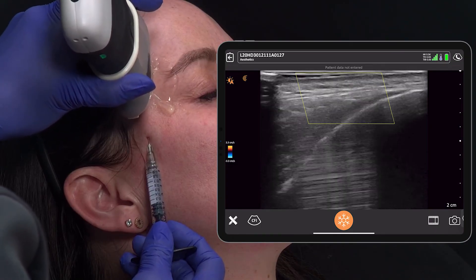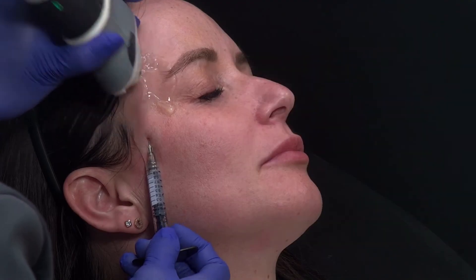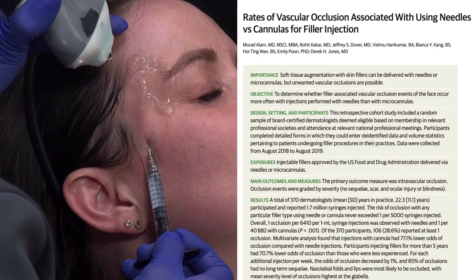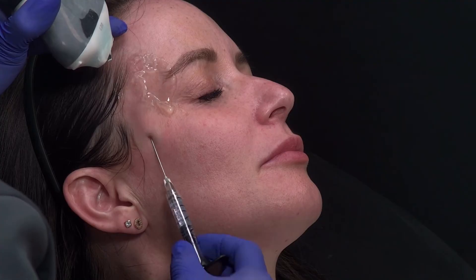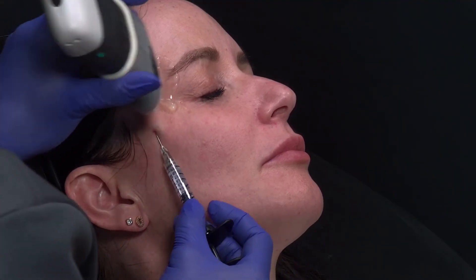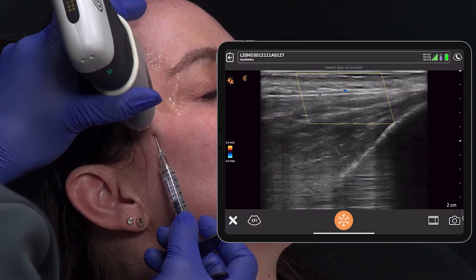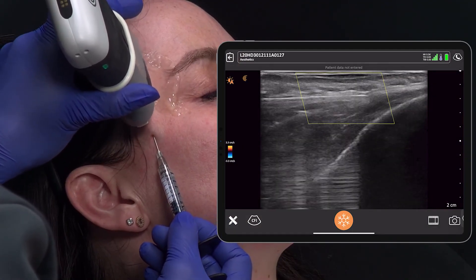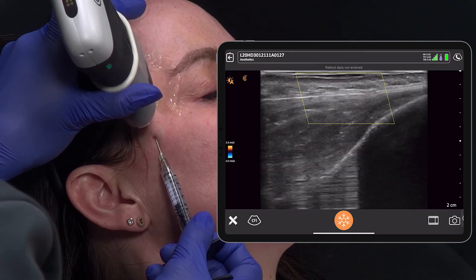You can see I'm using a 22-gauge cannula here, which is my standard gauge for most things. Although the 2021 ALAM paper alludes to cannulas being 77% safer than needles, I have seen some nasty occlusions — and very recently one of the temple. So this is why I always confirm my position with respect to the vasculature before injecting. Of course, it also improves results. Being in the right layer is not only safer, but you get a more predictable outcome using less product.